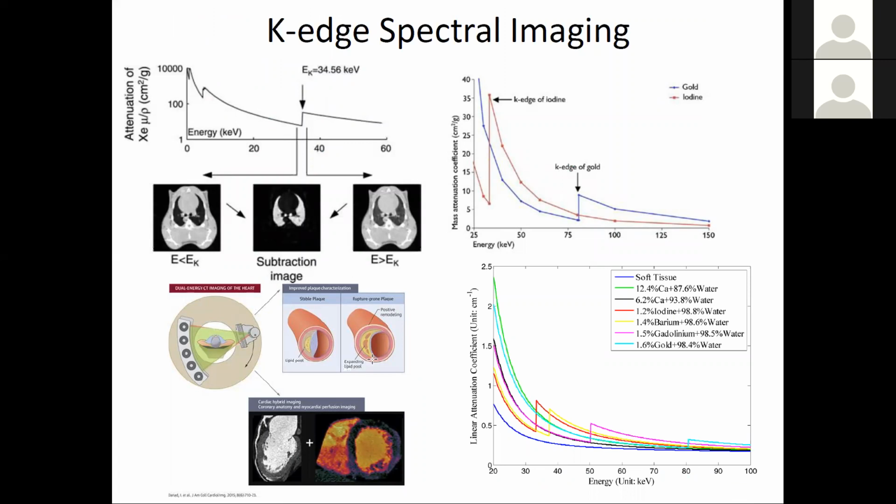So the other thing you can do, if you have multiple energy bins, is pick up K-edges in principle. Before, we said that if you only have dual energy, you can make anything out of two materials, because there are only two physics processes underlying it as a substrate: photocapture and Compton. If you have a different kind of photocapture where you're below the K-edge, then that's a third basis function. So essentially you can separate out a third material.